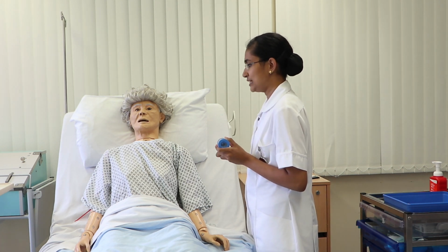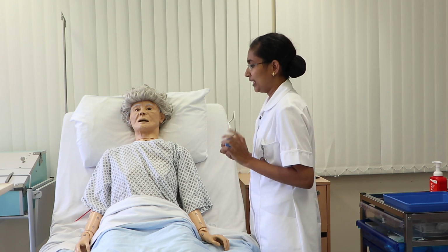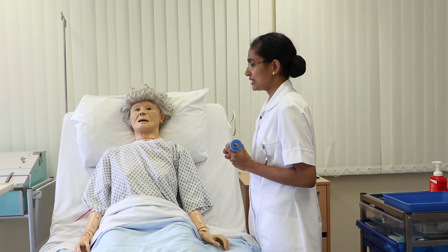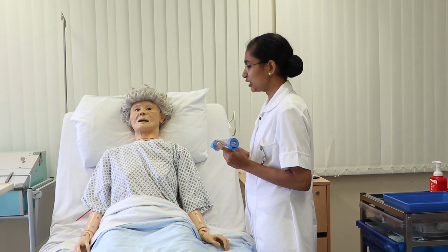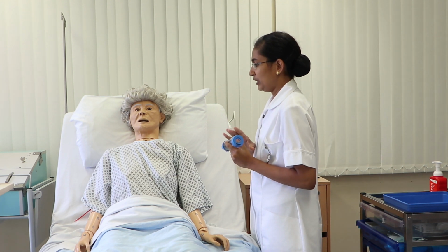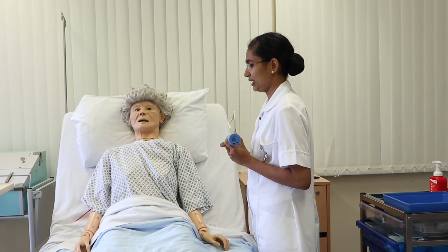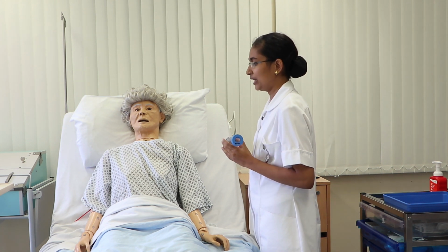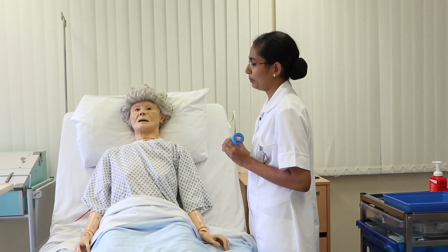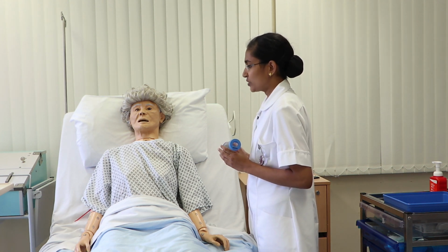Okay. Before the procedure, there are some instructions. Before the medication administration, you have to take a couple of respirations. During your second exhalation, I will connect this mouthpiece to your mouth, and after having the medication, you can have a set of 5 normal respirations. After the final respiration, I will remove the mouthpiece and you can exhale through pursed lips. Is that all right? Are you all right with my instructions?